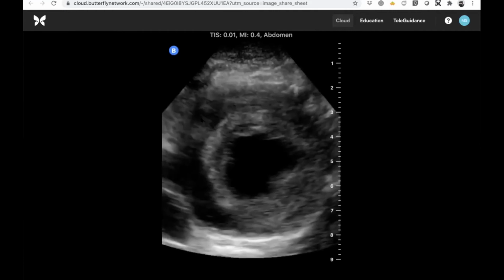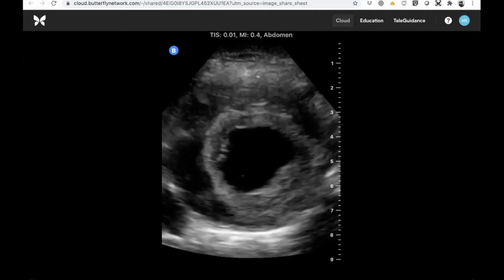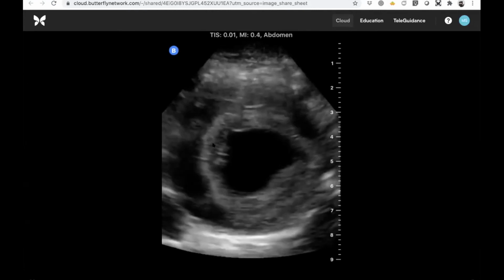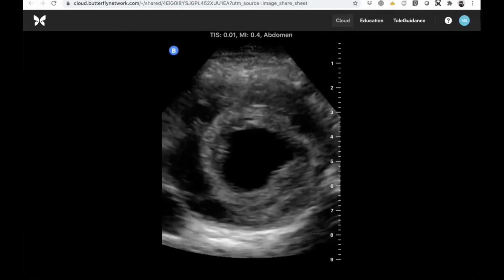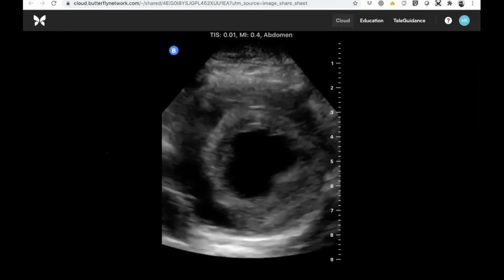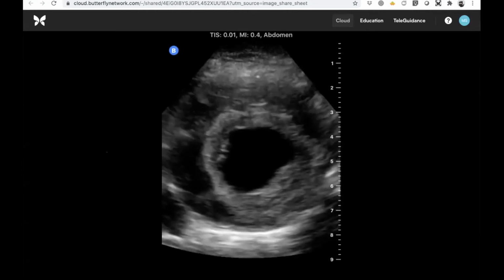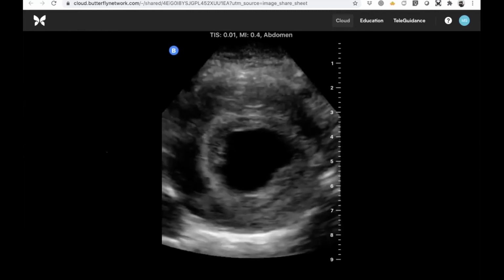And there's this large structure in the middle, seems kind of pulsatile, irregular wall to the inside. What do you think is going on here, Rachel? Well, that's really hard. It doesn't seem like it's pulsating very well. So I'm very concerned about the circulation that's happening in here.